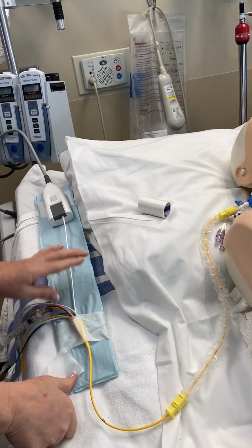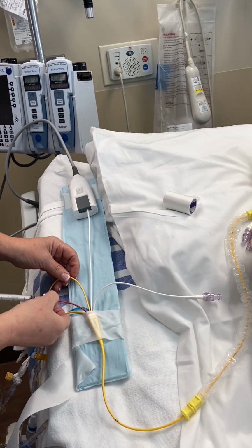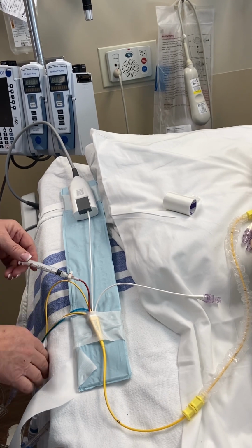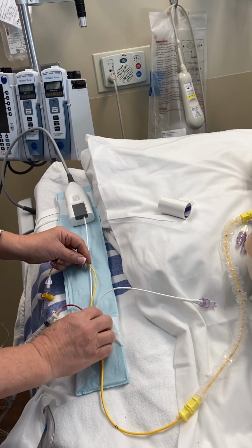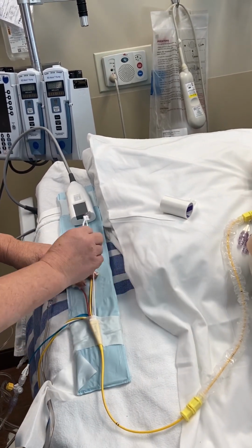Let me stop right there for 1 second and say, always remember your infusion port you should leave out kind of to the side, and your wedge syringe leave kind of out to the side. The purpose of that is because if your Swan is out and Dr. Hoffman needs to advance it a little bit, then you have that. You don't have to take the tape and stuff off.